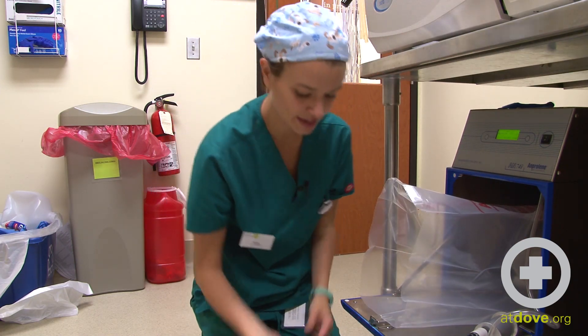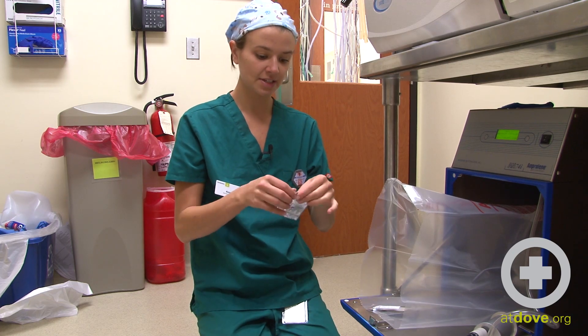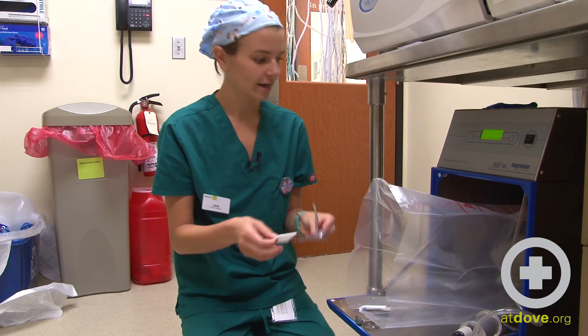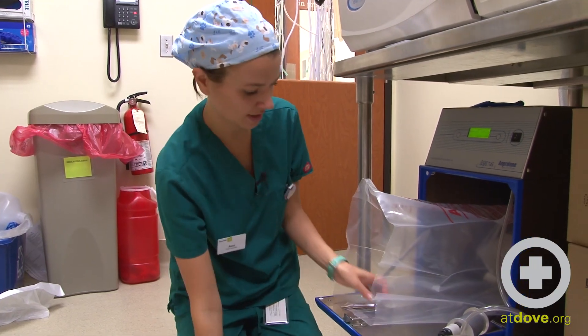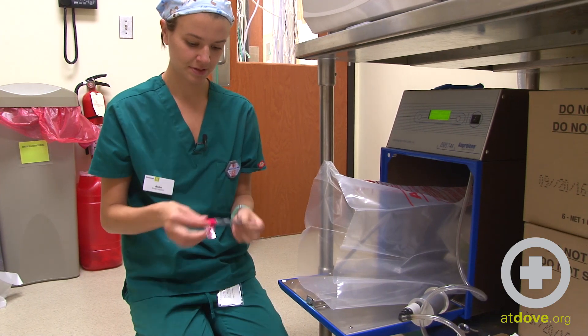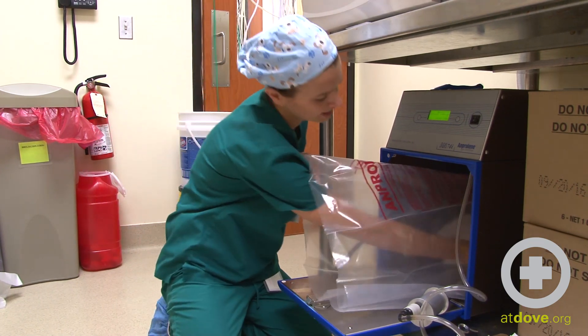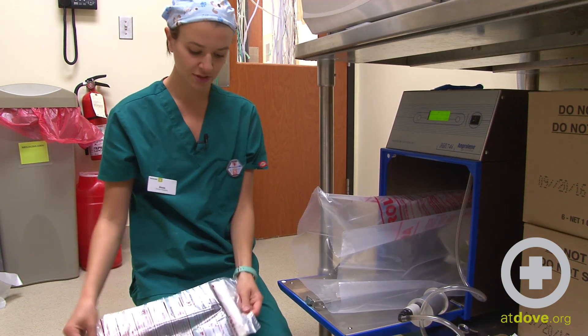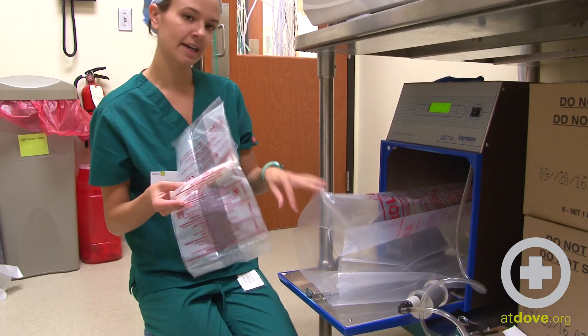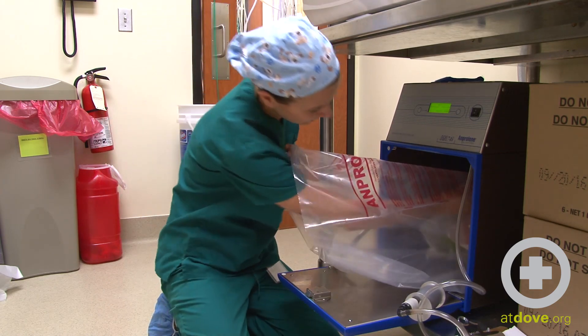And then I can start to add the things that I need. So I can open up my humidity chip and I'll put that in the bag, and then I'll add my dosimeter. I'll put that in there. I want to move the ampoule to the center of the bag just by pushing it like that. And then last thing is I'm going to put this in the bag.